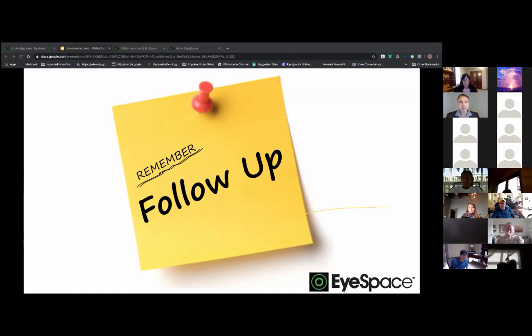And if you haven't been behind the slit lamp, go and do it later today or tomorrow. Let one of your staff members shine that bright light in your eye. It's very hard to have a normal blink reflex sitting behind the slit lamp, and therefore the blink forces have an influence on the lens. And obviously, you're in an upright position when you're not sleeping.